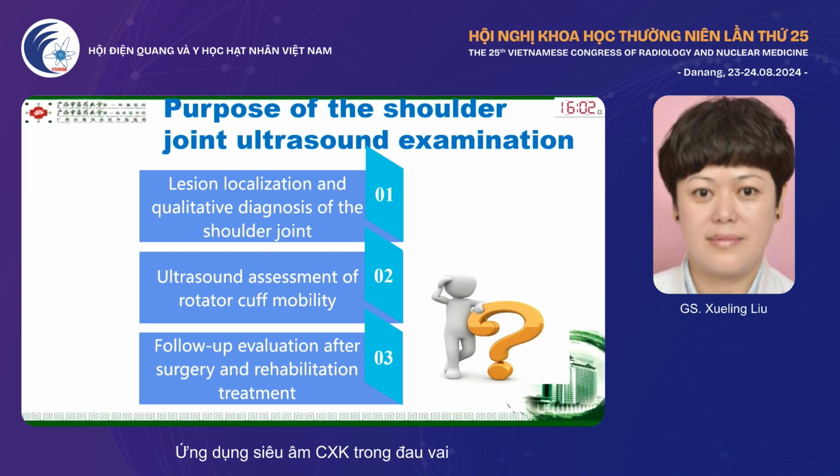The purposes of shoulder ultrasound examination are lesion location and differential diagnosis of shoulder pain, ultrasound assessment of rotator cuff mobility, and follow-up evaluation after surgery and rehabilitation treatment.